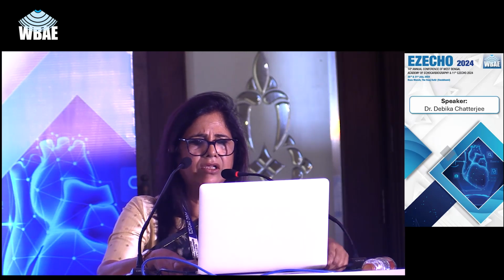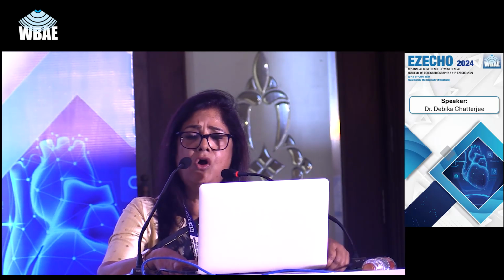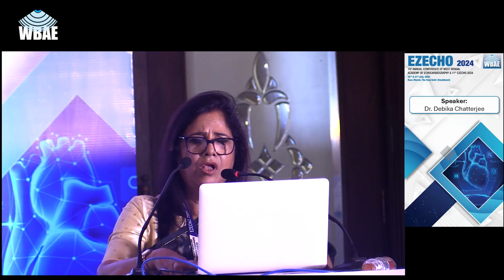We always look at the mean gradient because it corresponds well with the one measured by cath in the cath lab, I mean cardiac cath. And as per the latest guidelines, if it is more than or equal to 40 millimeter of mercury, we say it's severe. However, look at this patient, a similar patient with similar clinical background.